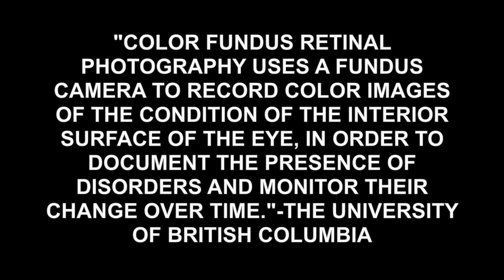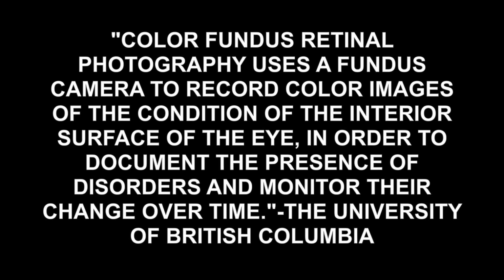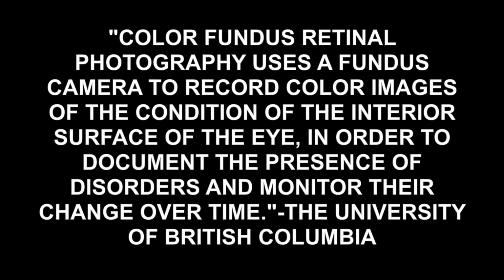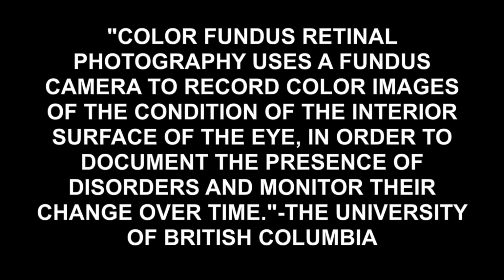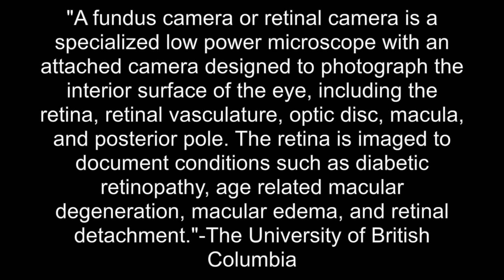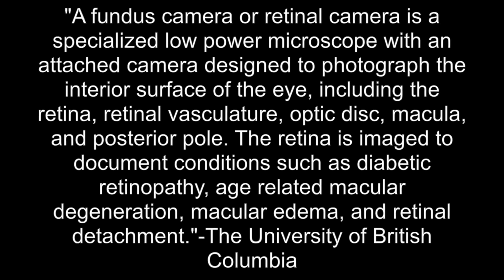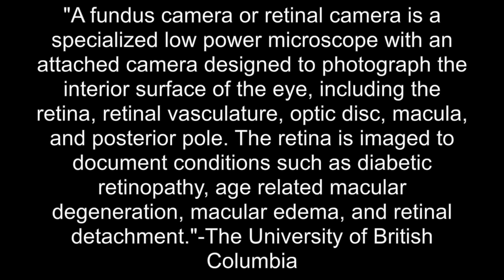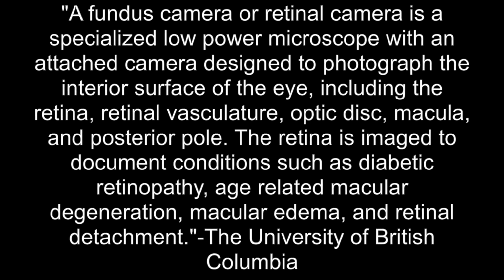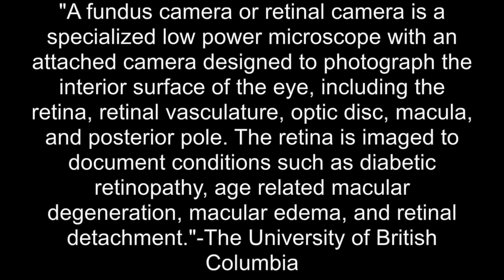By definition, color fundus retinal photography uses a fundus camera to record color images of the condition of the interior surface of the eye in order to document the presence of disorders and monitor their change over time. A fundus camera is a specialized low-power microscope with an attached camera designed to photograph the interior surface of the eye, including the retina, retinal vasculature, optic disc, macula, and posterior pole. The retina is imaged to document conditions such as diabetic retinopathy, age-related macular degeneration, macular edema, and retinal detachment.